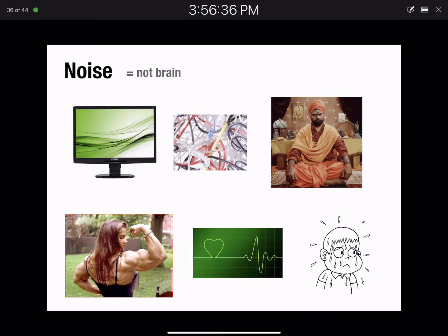Something like if you start scrunching your muscles, as long as you're contracting that muscle, you've got this oscillating frequency pattern that will be picked up in your electrodes. And if you've got muscle activity on lots of trials because the person's tense or they're squinting at the screen or something like that, it's not necessarily going to average out across trials because it's present on lots of, if not all, the trials. So it is important to try and minimize those things as much as you can, even though there are ways of dealing with them later.